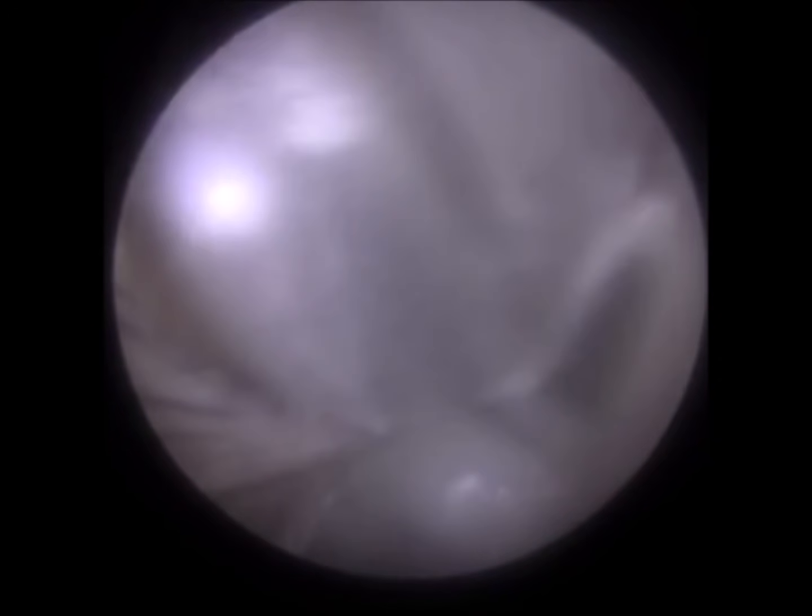I have a very interesting case here. A client attended a few weeks ago and he mentioned on the phone that he's got an ear infection in the right ear. He's had treatment for the last couple of months, he says, with his GP, but there's no improvement. So just looking in the right ear, you can see all this discharge, how damp and wet it is, and that's making the screen a bit blurry.